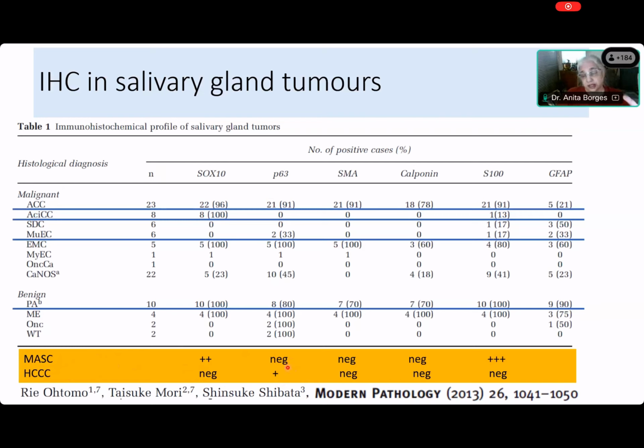And it does not say whether this is a basal cell or a myoepithelial cell. And you see here that S100 protein is expressed in the secretory carcinoma. In fact, it's one of the defining expressions in secretory carcinoma.